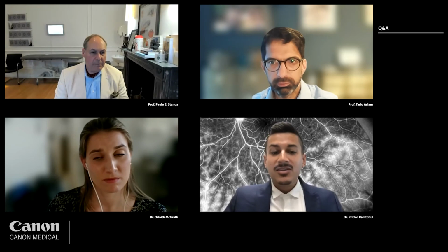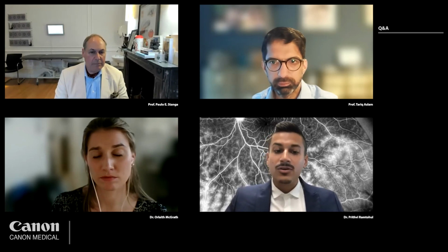And this is a question for everyone. Are we there with OCT angiography for using it in everyday clinic? Do you use it in everyday clinic? Let's start with Prithvi. Yeah, I mean, in New York, we use it every day for imaging macular neovascularization. So most of the patients we treat here are macular degeneration patients. So we mostly use OCT angiography for all our patients, yeah.